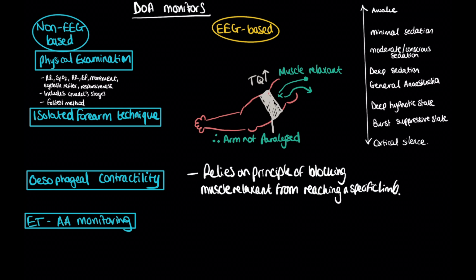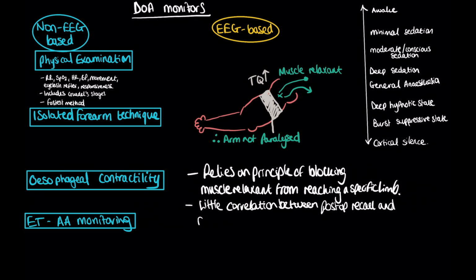There are significant limitations to this technique in that there is little correlation between post-operative recall and being able to respond to commands. In other words, even if a patient does respond to your command, there is little correlation that this will mean the patient will be able to remember the events of the surgery explicitly. There is also some controversy in whether inflating the tourniquet for more than 20 to 30 minutes can cause ischemia-induced paralysis, thereby giving you a false negative. Some techniques have been developed to try and mitigate for this, but the controversy still remains.